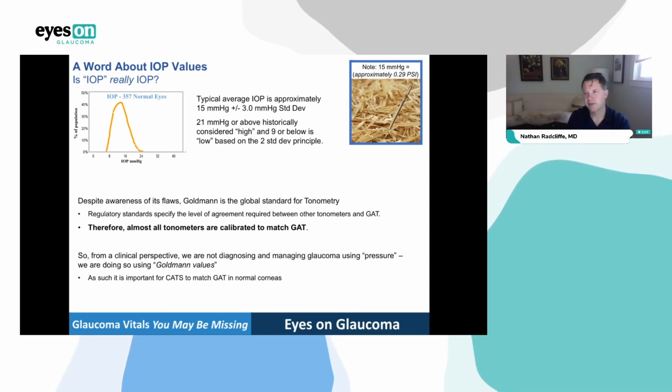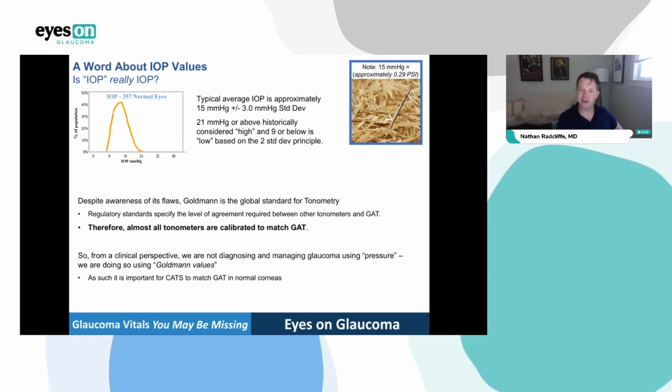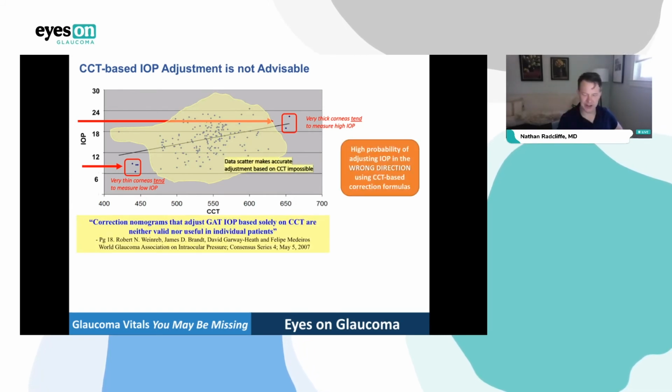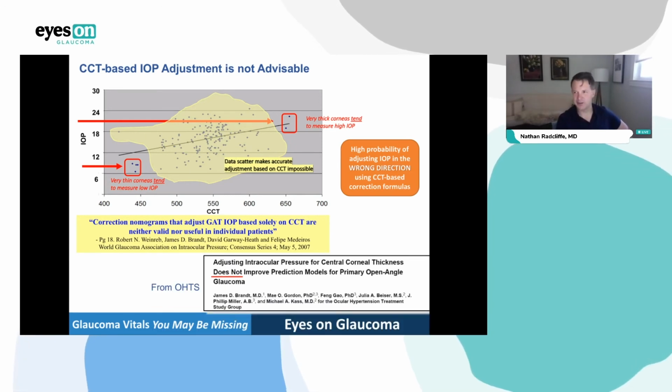corneas. I recently gave a talk on measuring intraocular pressure in the abnormal cornea, and the person who asked me to give the talk wanted me to talk about corneal scarring and corneal transplants, and I just talked about hysteresis because the most common abnormal cornea you're going to see in your practice is low or high hysteresis. You'll see them all day long. And, you know, we see scars, and you always wonder if you're getting a good pressure after a transplant, but taking care of the corneas that aren't normal in your practice is probably more important.